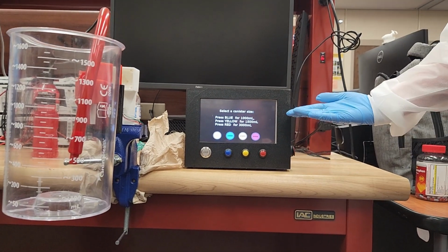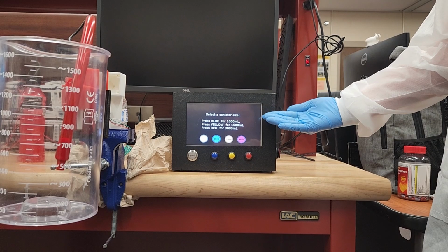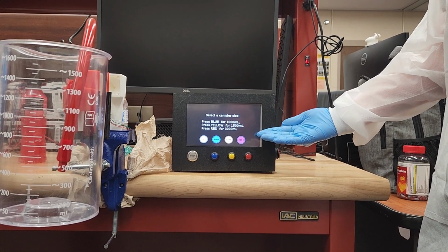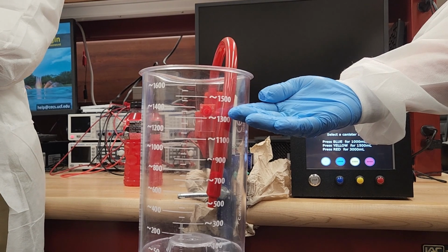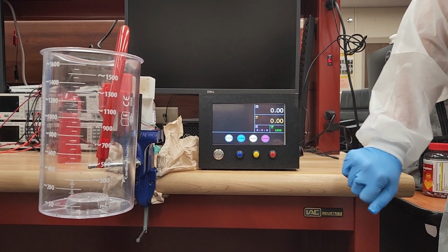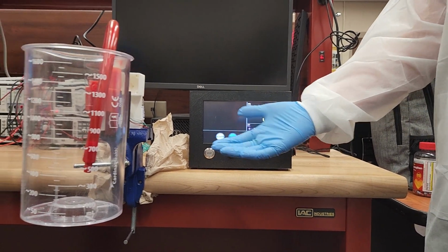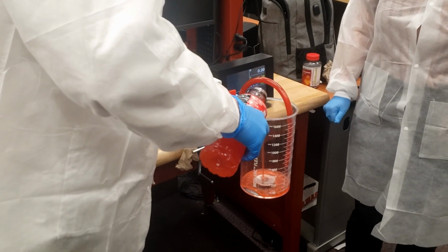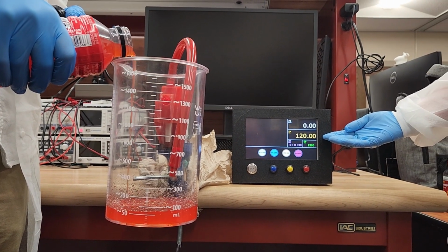Next, we select our canister size. Our options are 1,000 milliliters, 1,500 milliliters, and 3,000 milliliters. Our canister is 1,500 milliliters, so I will select the 1,500 milliliters. Now we are ready to begin tracking our blood loss. You can see the blood volume being tracked here.